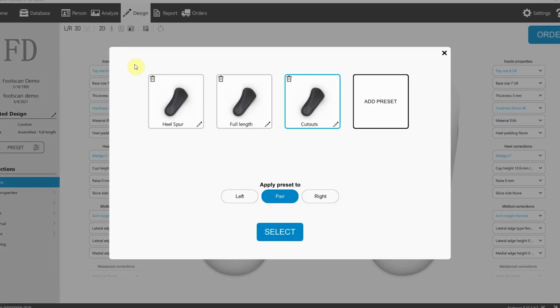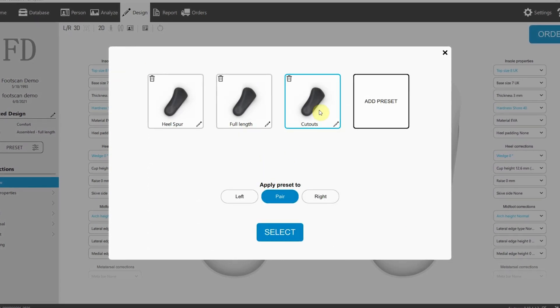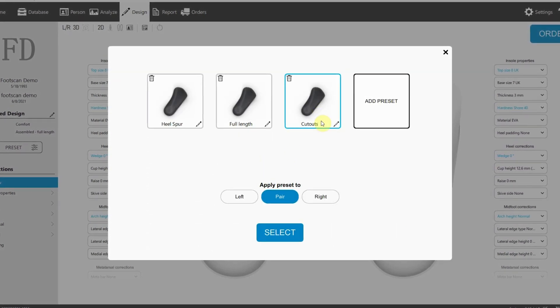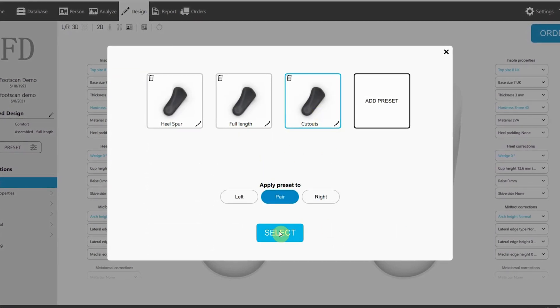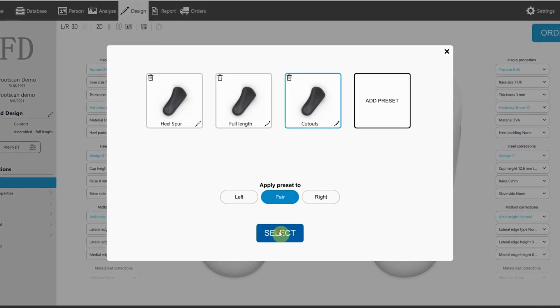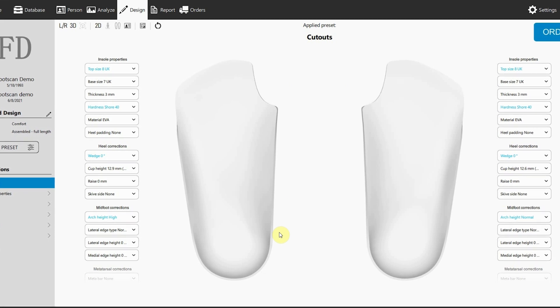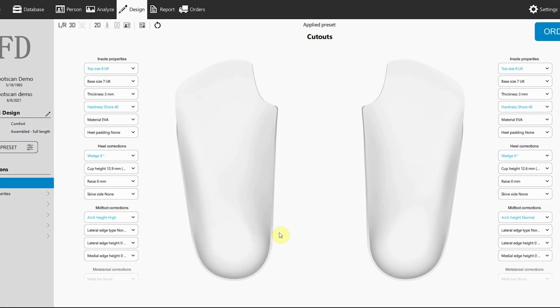Easily add new or existing presets, allowing you to start from a draft design that you can still tailor to the patient's needs afterward.